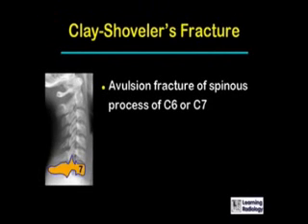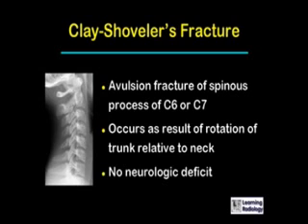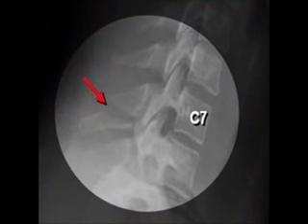Clay shoveler's fractures are avulsion fractures of the spinous process of either C6 or usually C7. They occur as a result of a rotational injury of the trunk relative to the neck. They are named for the original cause — individuals shoveling clay in which the clay did not release from the shovel. There is usually no neurologic deficit and they do not involve the spinal canal. This is an example with a horizontal fracture through the spinous process of C7, as indicated by the red arrow.